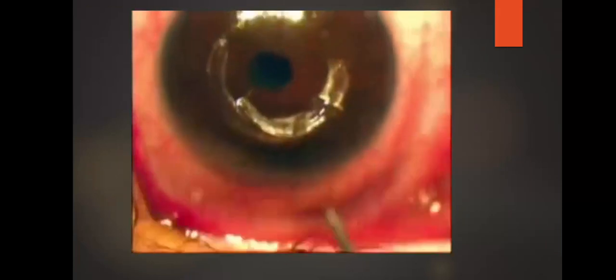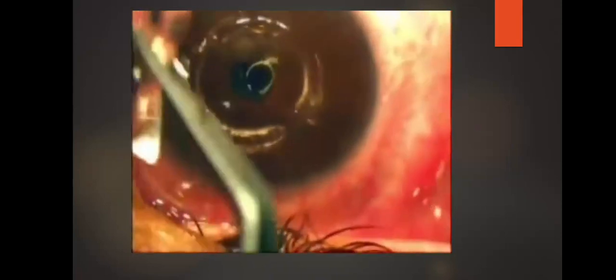We push the ring to keep it away from the incision site, and then we implant the other ring segment. Here we implant the other ring segment and introduce it through the wound. Finally, we apply the soft contact bandage lens.